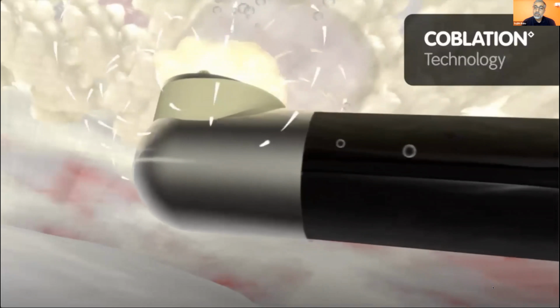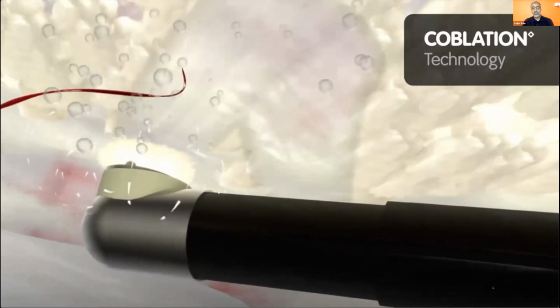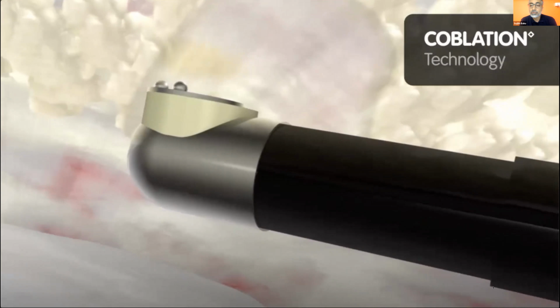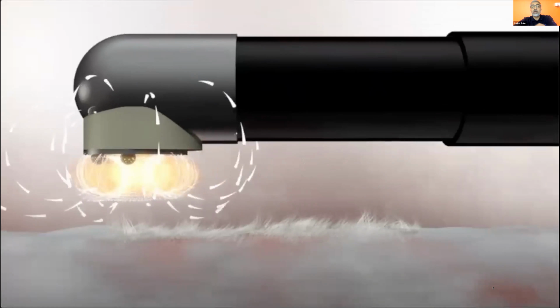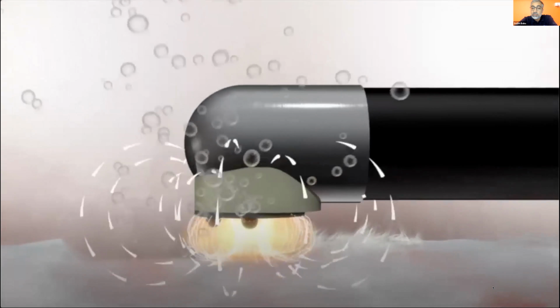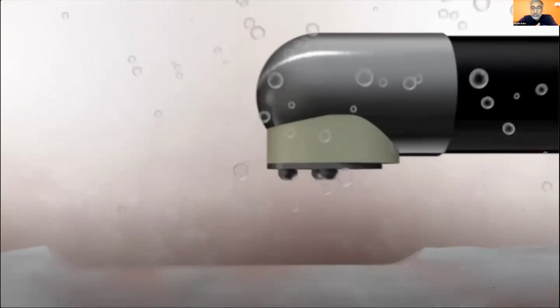It was used initially in arthroscopy surgeries and later introduced in ENT. The cutting tool is called the wand. Applied to the surface, it produces a layer of plasma, and that cuts. It removes a volume of tissue without causing the problems of ablation.